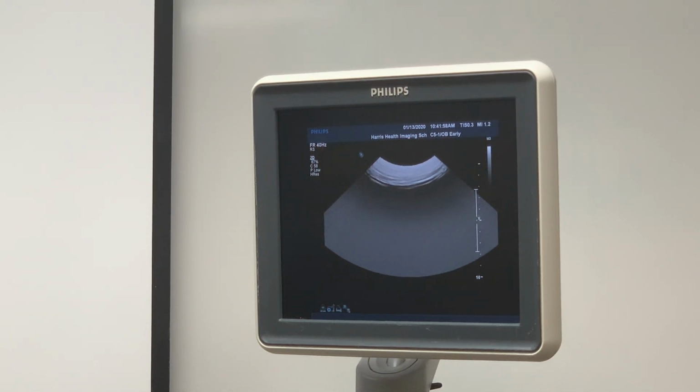You sacrifice the temporal resolution, but you get a bigger picture. Right. And like I said, if I just need a 2D image, then the temporal resolution doesn't matter to me. Again, temporal resolution only matters if I need to make a movie.